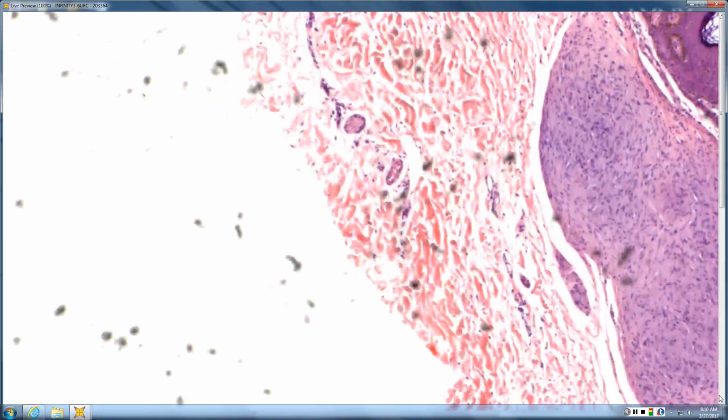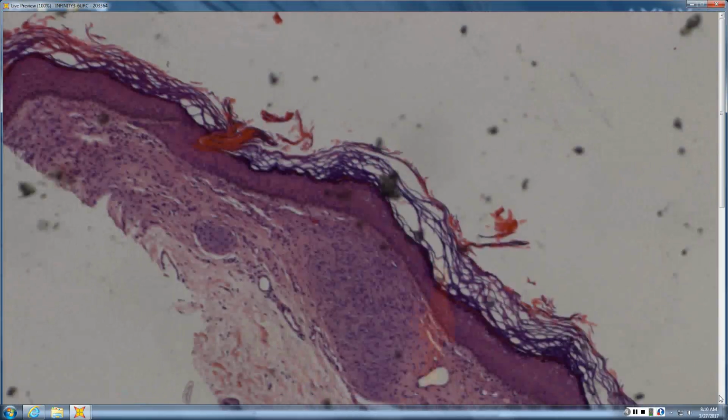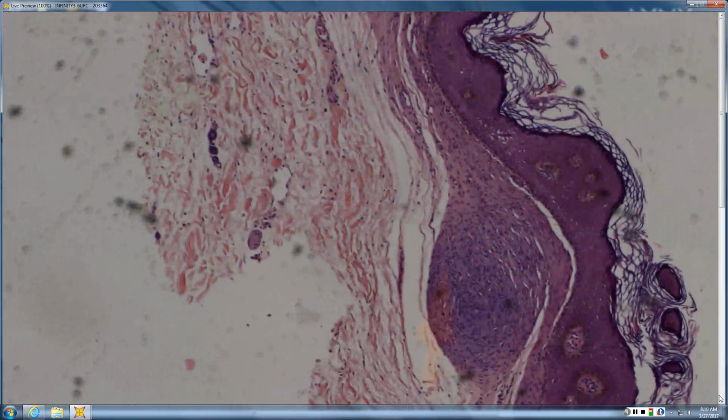Oh, perineurioma. So a sclerosing perineurioma, if it is confirmed by immunostaining with what? So perineurium stains with EMA, epithelial membrane antigen. So the normal perineurium is EMA positive.